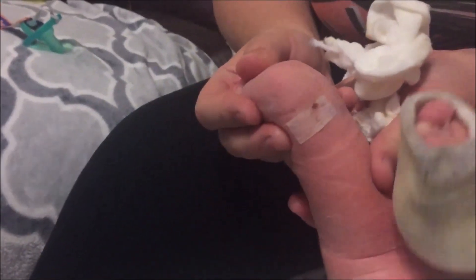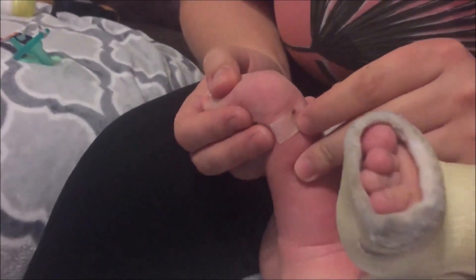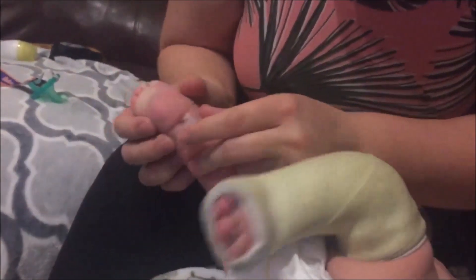You can see it — there's a little steri-strip over the pinhole. It's coming out. It turns where they like — do it this way. That's probably going to hurt a little bit. Oh, it came right off! Good boy. Yep, completely healed — literally completely healed. You can see a little circle but it's like there's nothing there. Good boy! Yay — that's one!